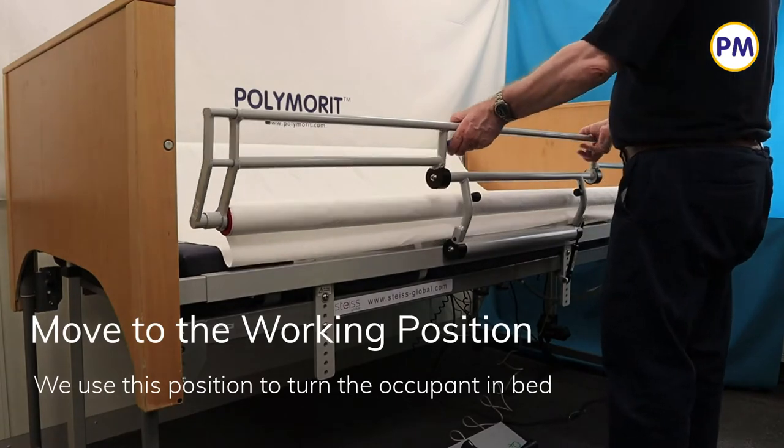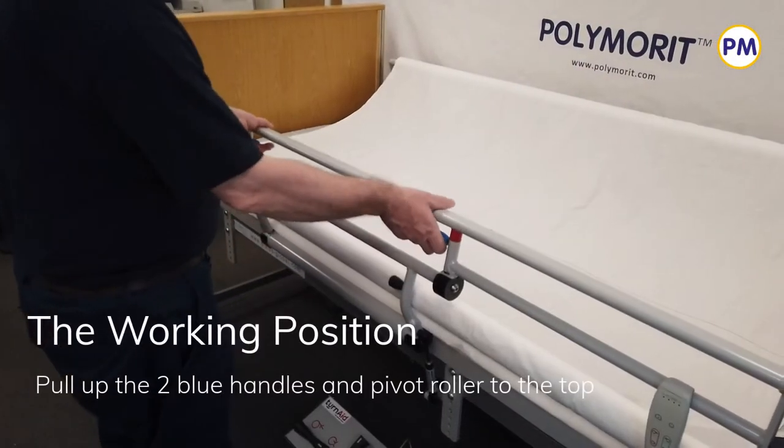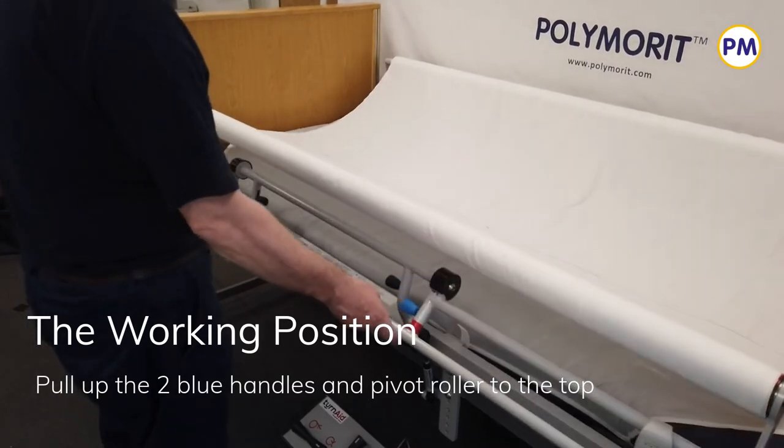We use the working position to turn the occupant in bed. Lift up the two blue handles and pivot the rail so that the roller is at the top.